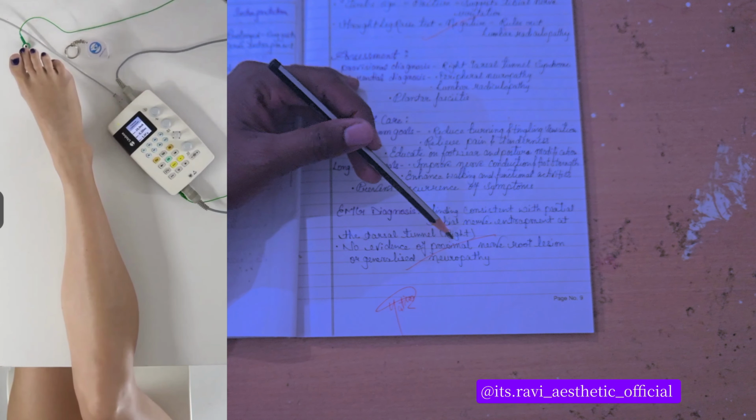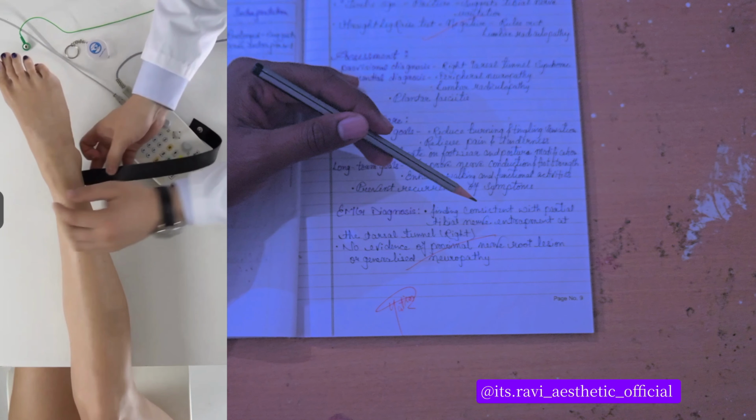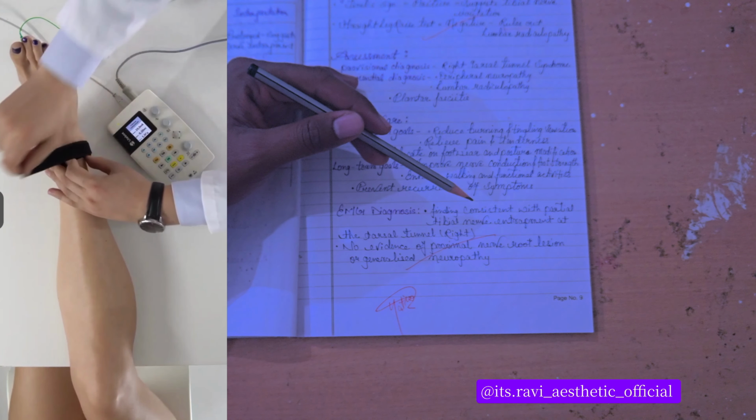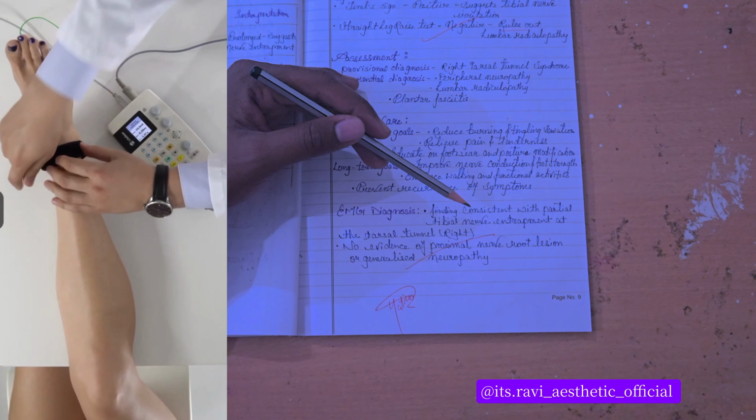No evidence of proximal nerve root lesion or generalized neuropathy. There is no kind of lesion, no kind of neuropathy on that place, because there is no trauma to the patient. So there is only nerve irritation.